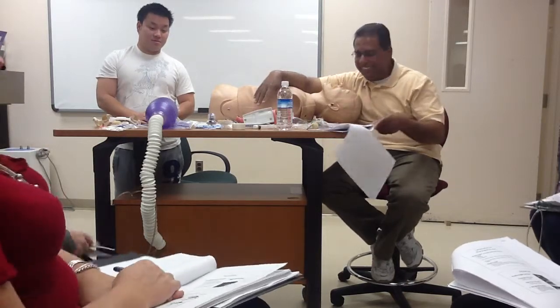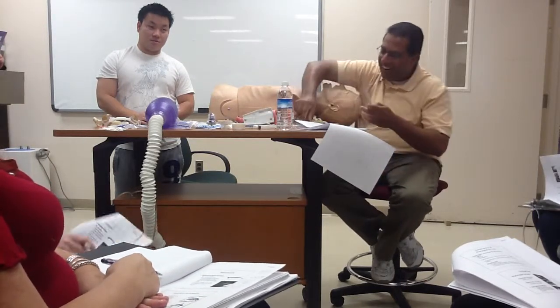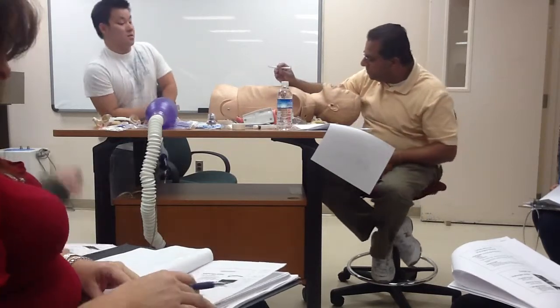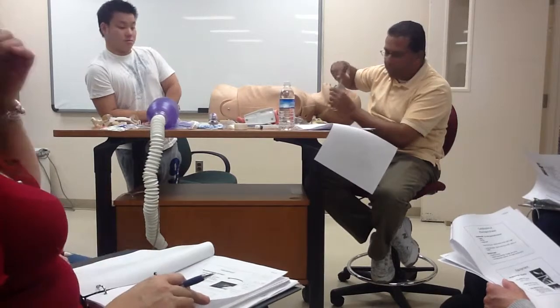Relax. They'll be looking at their book. So, what does that mean? My sentence, I use that, so start one sentence. Alright, now, how do you measure this? The earlobe to the tip of the nose, the size of the naris. Yeah, you gotta do that first.